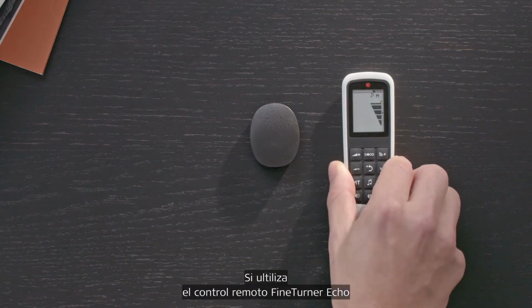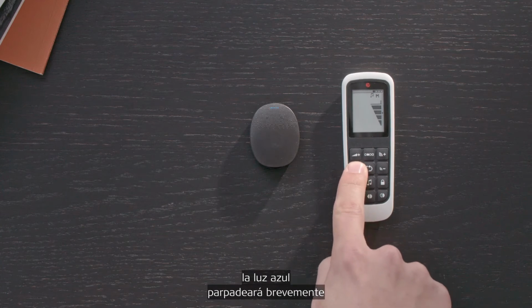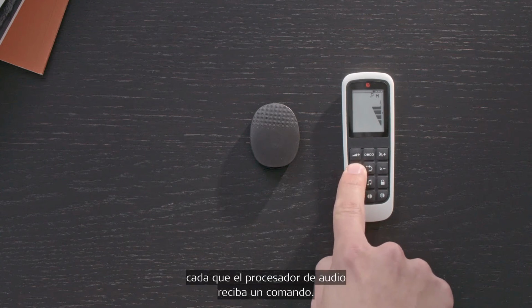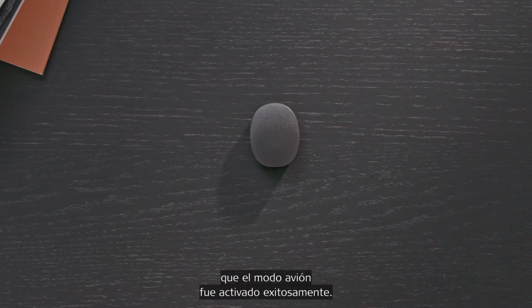If using the Fine-Tuner Echo remote control or Audio Key 2 app with your Rondo 3, the blue light will blink briefly every time a command is received by your processor. A short red blink means that the flight mode has been successfully activated.